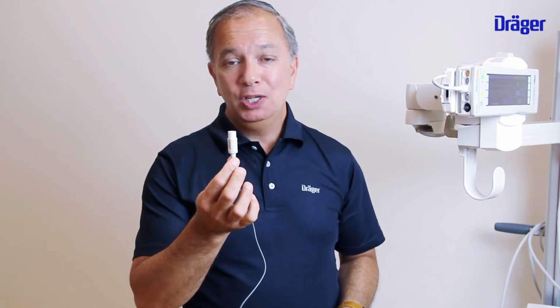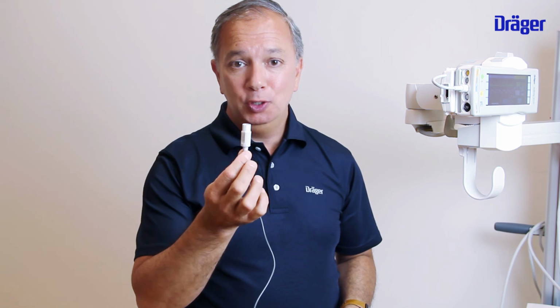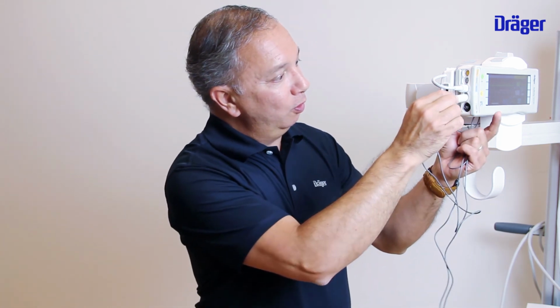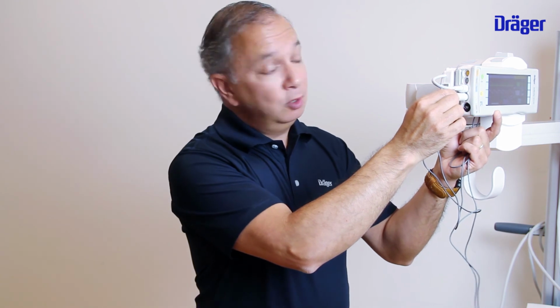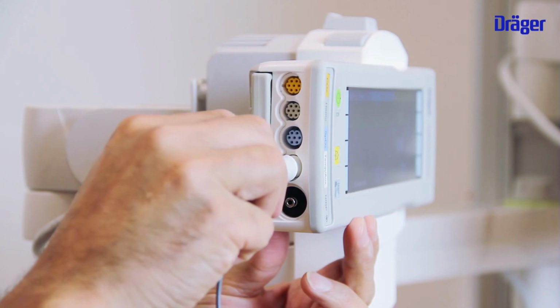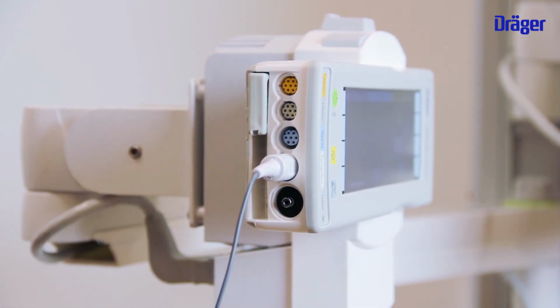The white one is your temperature connector. It's all color coded, so put your white temperature connector into the white connector on the monitor. At this moment, don't use force to connect it to your monitor. When it doesn't fit, please turn it around until you feel that it's alright, and then you push it into the monitor.